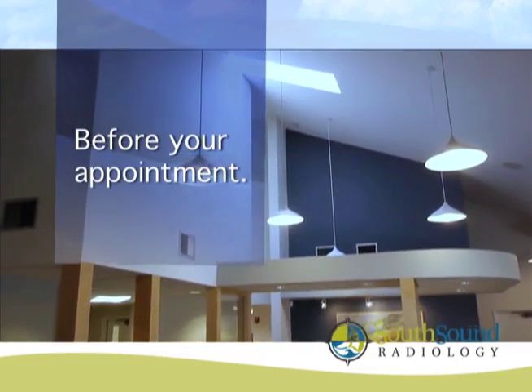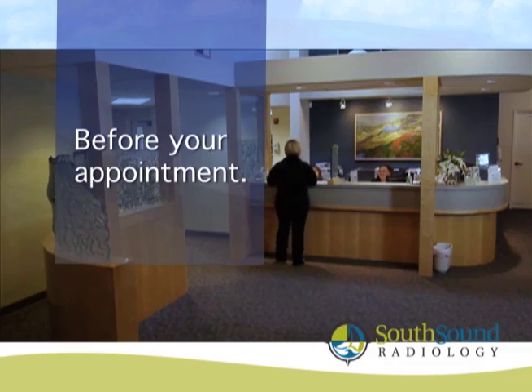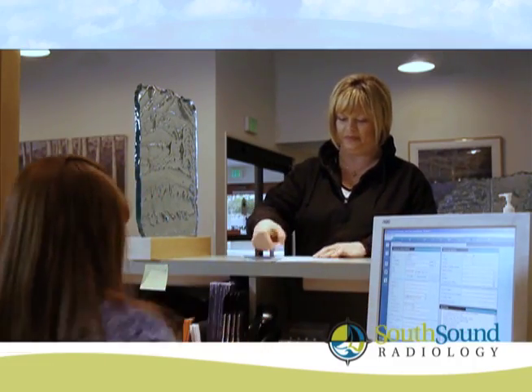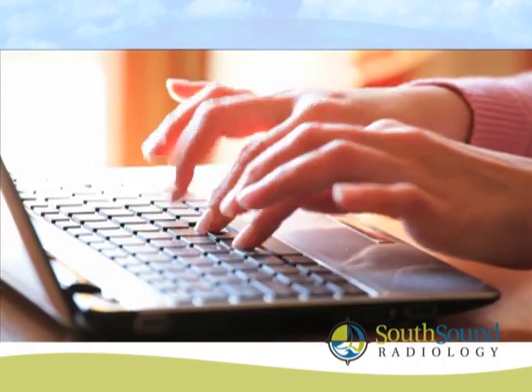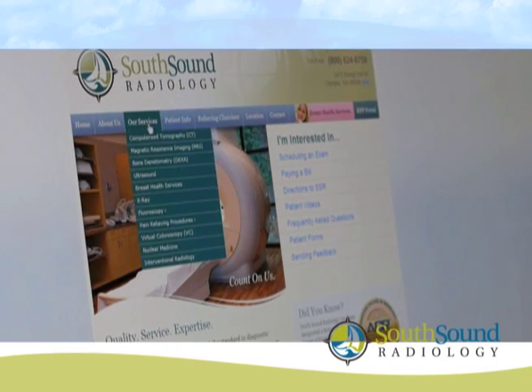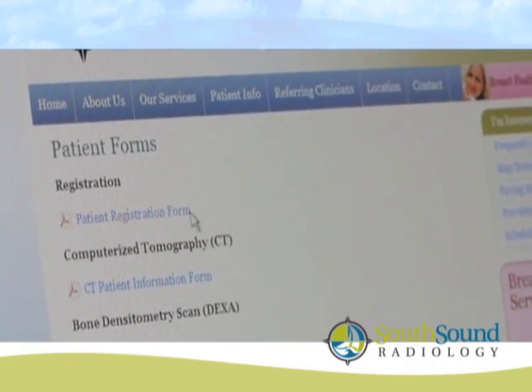Before your exam, a technologist will review with you the informed consent document as well as any special preparations that may be required. The informed consent document provides an overview of the procedure, desired benefits, possible risks, and your rights as a patient. If you are viewing this video on our website, you can access the informed consent document under Patient Information. Please be sure to discuss any questions or concerns you may have with a technologist or radiologist.